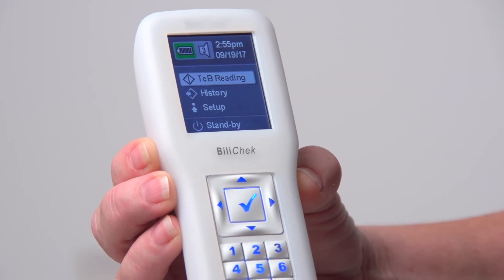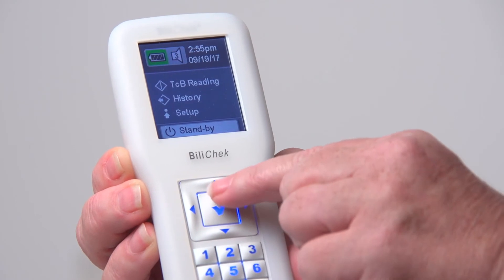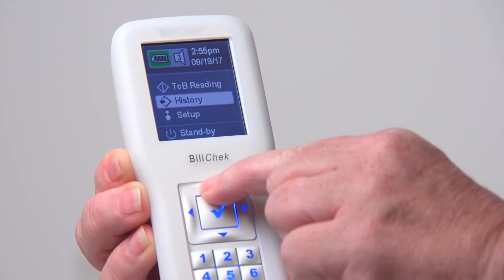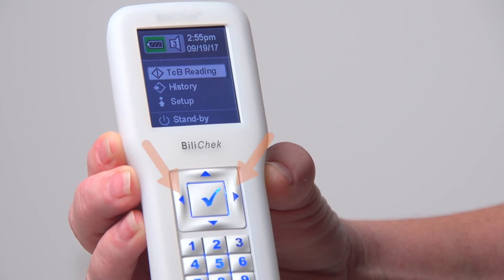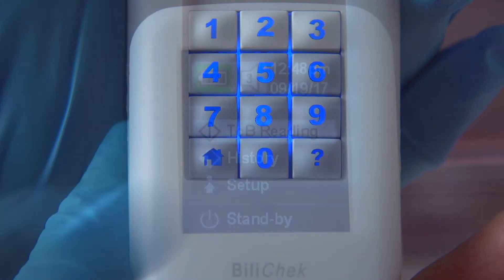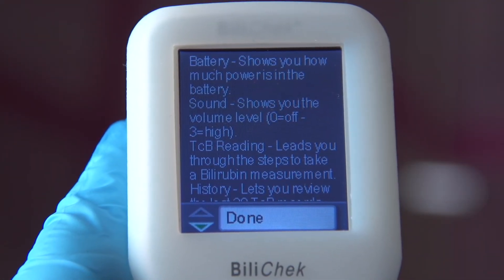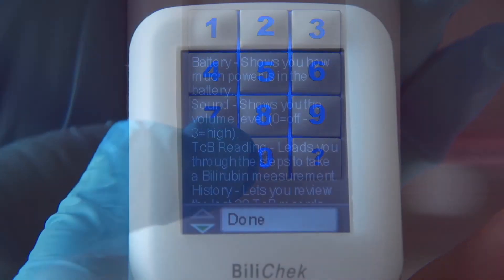Operation of the Billy Check involves using the keypad to navigate through the on-screen menus. Use the up and down arrow keys to scroll through the menu options and settings. Use the left and right arrow keys to perform the actions specified on the screen. Use the enter key to save the setting. Press the help key at any time to display instructions for that action. Press the home key to return to the home screen at any time.